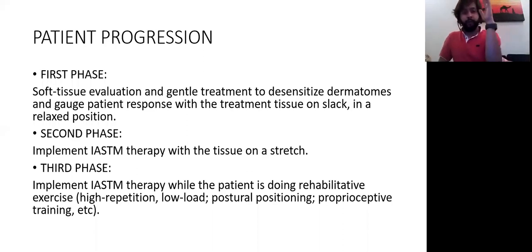I will move my blade along the movements, going back, stretching the part, coming up, coming back again, stretching the part. This is an active approach. You can use an active approach on any patient if you feel the patient is already pain-free with mild stiffness, on quads, calves, anything. But again, you have to see which phase.